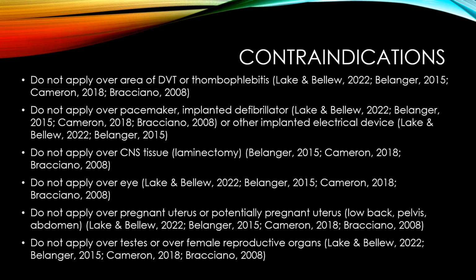Do not apply therapeutic ultrasound over the eye. Same reason as you wouldn't apply it over the breast implant. You don't want to heat up the fluid inside of the eye. That would be bad. Do not apply ultrasound over a pregnant uterus or potentially pregnant uterus.